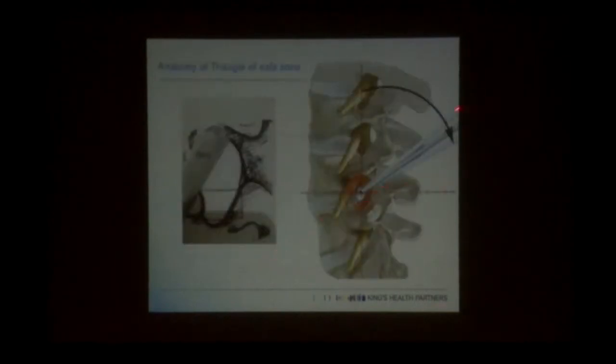So that's how we start, using the dilators or reamers. And once we remove this facet, or we ream this facet a few millimeters, we just need a few millimeters. When we ream this facet a few millimeters, we are violating the Kambin triangle, we are increasing the diameter of the Kambin triangle. And when the Kambin triangle becomes bigger, it's safer. That's why we never try to come down and hit the nerve directly. Whenever we place the first needle, we come straight on the bone, and then we can walk through the bone. We never try to get straight into the foramen.